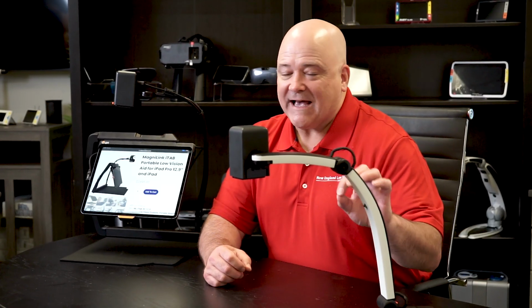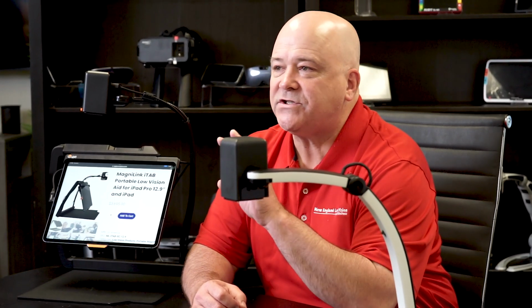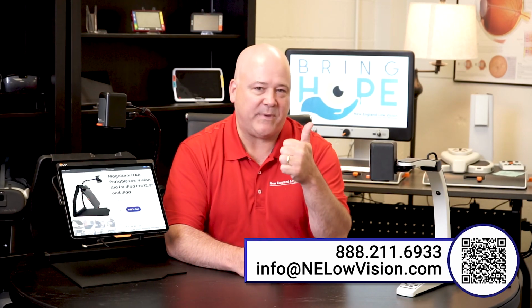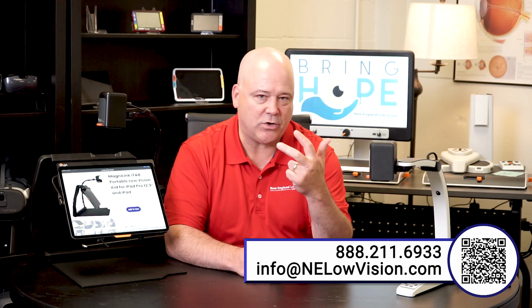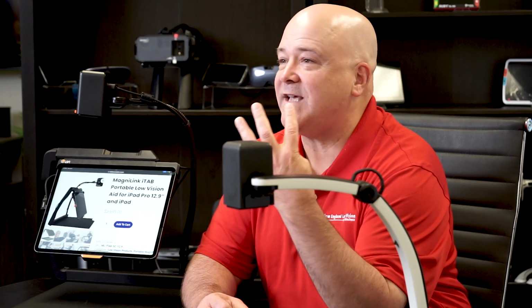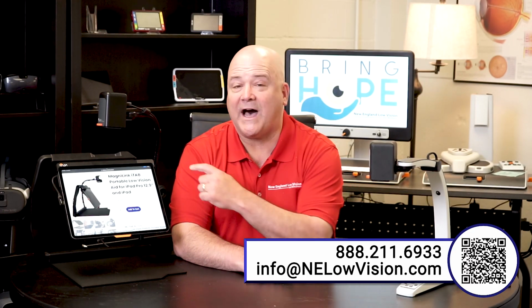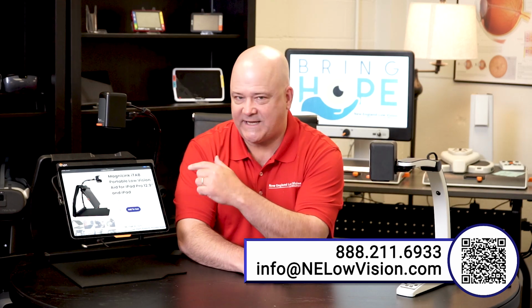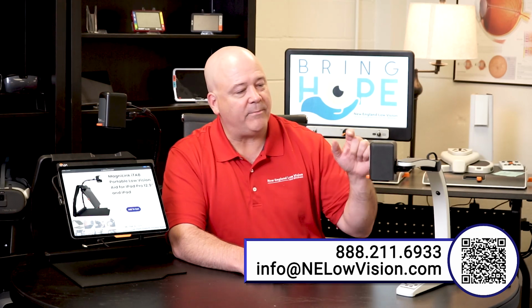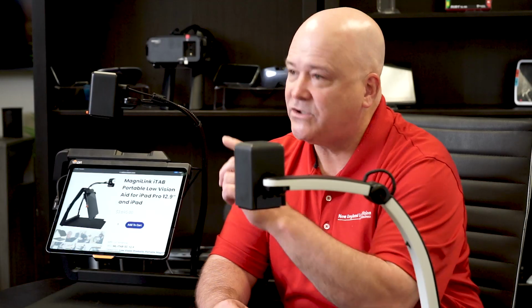The MagniLink S, why I have that here before us today, is to let you know that it used to connect to three mediums. The first one, PC, second was a Mac, third was a Chromebook. All very good. But what it did not connect to was an iPad until now. So with the invention of the MagniLink iTab, where we're using the technology to connect to your iPad, you can also use your MagniLink S to connect to that fourth medium, to your iPad.